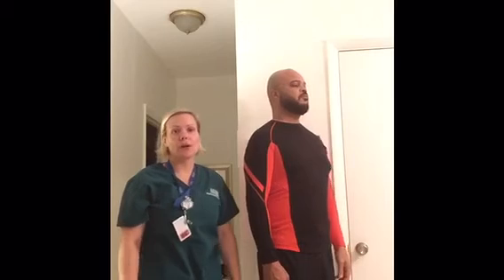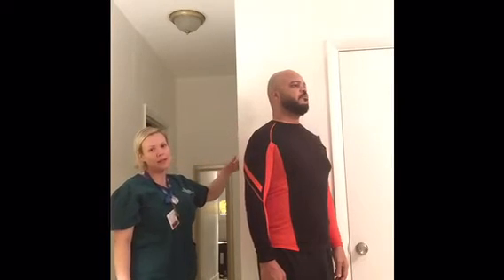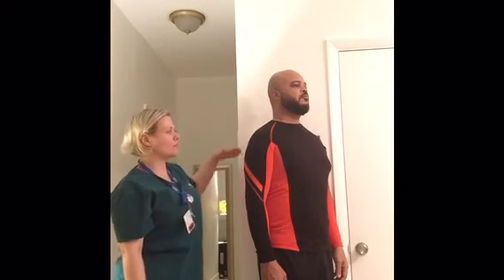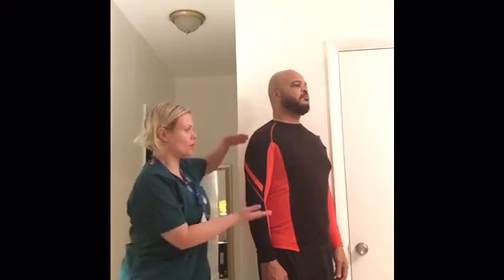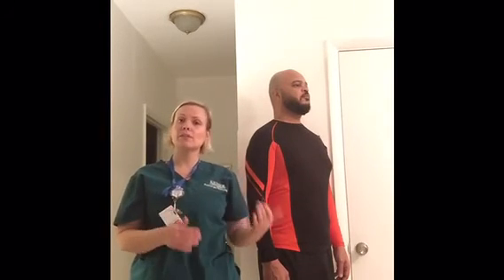And for the lower ribs, we're going to do the same thing. We're going to move the bucky down a little bit, and of course align your tube. So the central ray is midway between the xiphoid process. You use the same trick about the iliac crest, that way you know that you won't clip anything. And the exposure should be on expiration, so you ask the patient to breathe in, then breathe out and hold it, and then you expose.